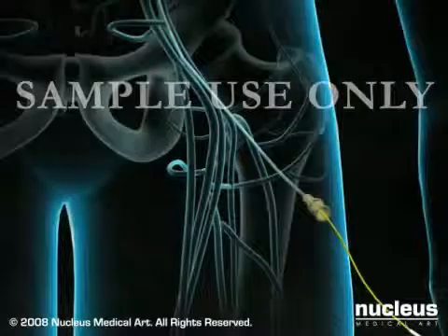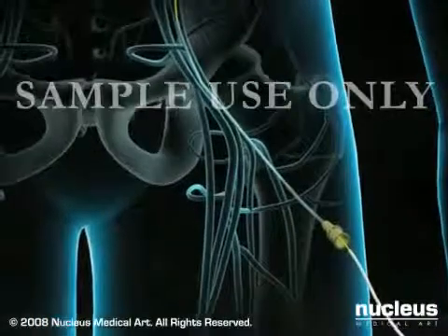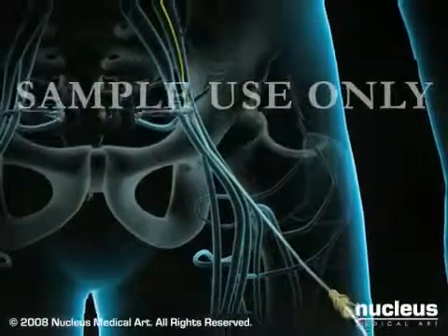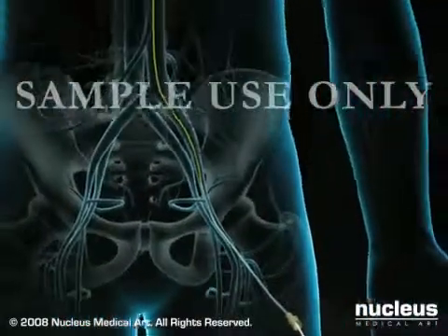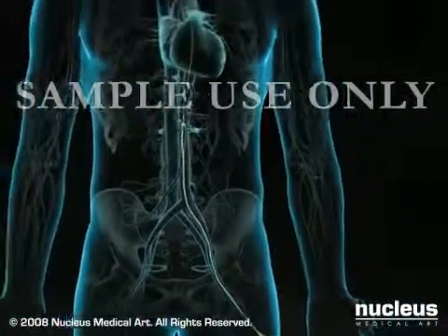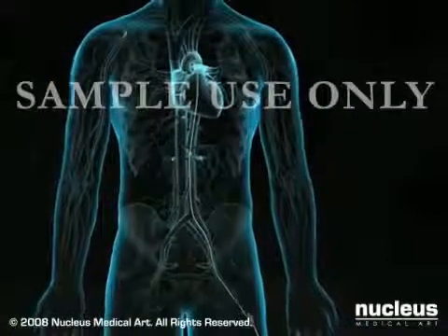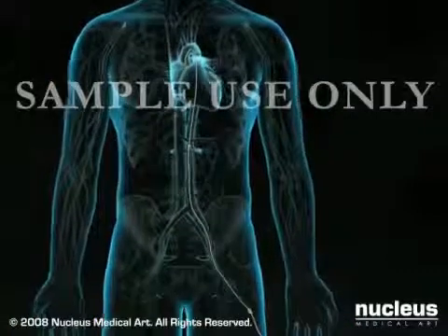clots. Next, a soft, flexible catheter is slipped over the wire and threaded up to the heart. The procedure is monitored using a continuous X-ray imaging device called a fluoroscope. You may feel pressure as the wire and sheath are inserted through the groin and pushed through the artery, but you will not feel their movement inside your arteries.